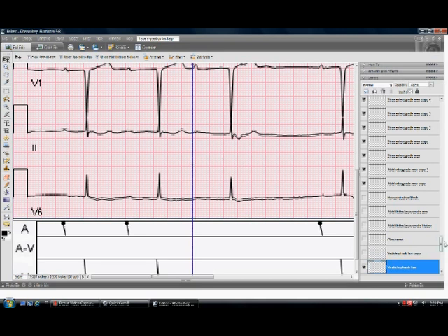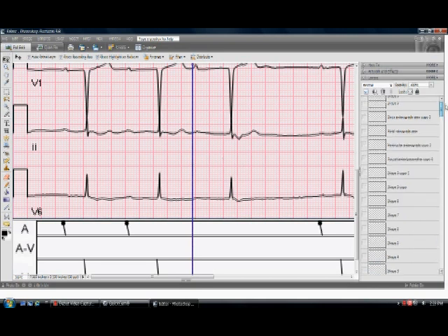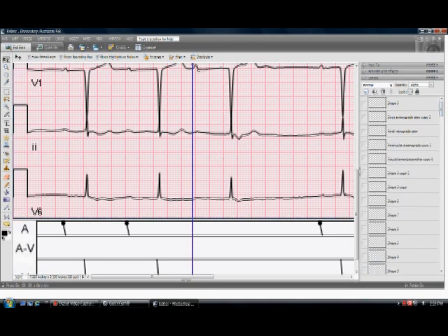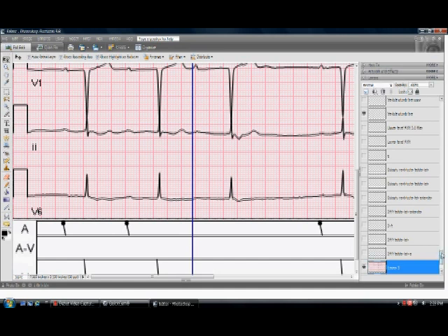And what I will do is once I've lined it up with the beginning of the sinus P-wave here, come straight down and in that tier, in the atrial tier, I would add a slightly oblique line which is right up against that plumb line.